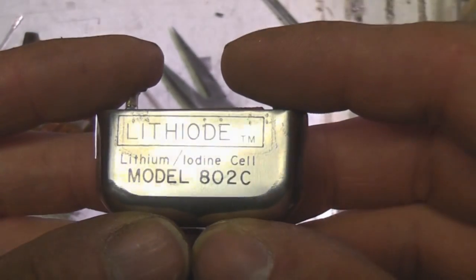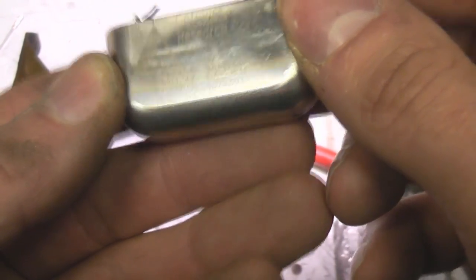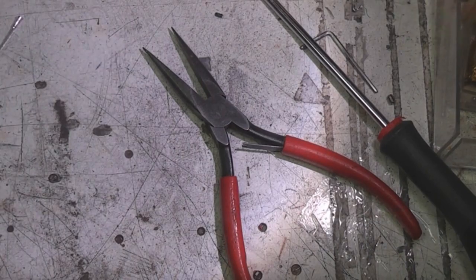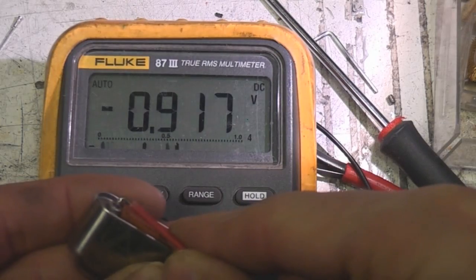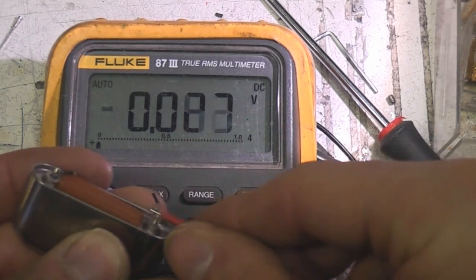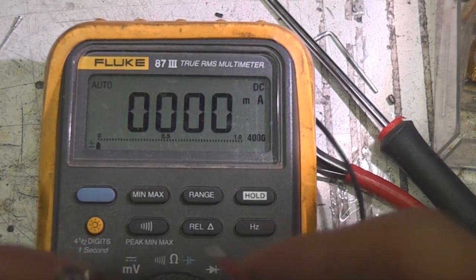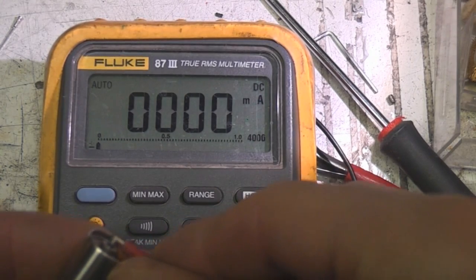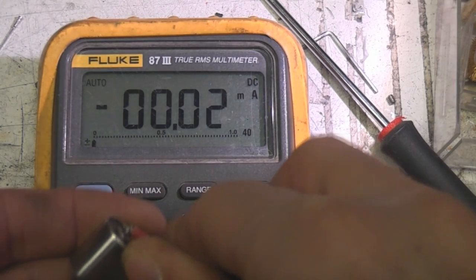This is a lithium iodine cell made by Catalyst Research in Baltimore. Let's see if it's got any life left in it. 2.7 volts with a short circuit current of pretty much nothing, so I think that's completely dead.